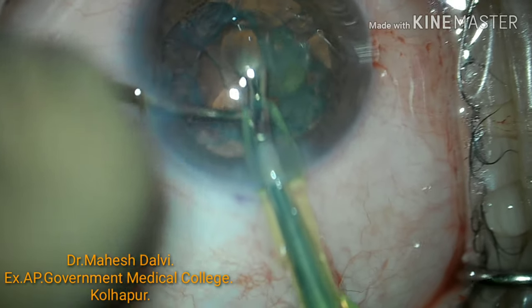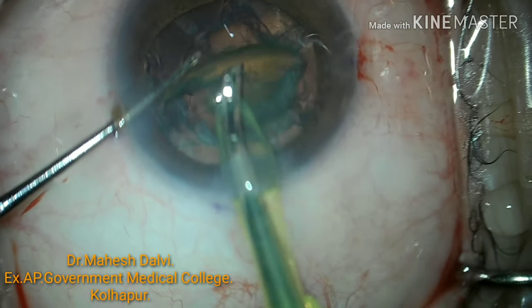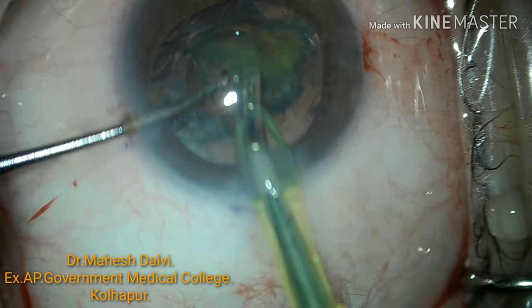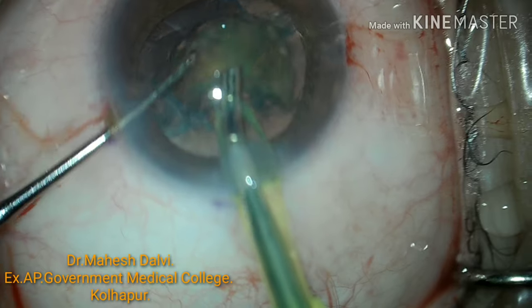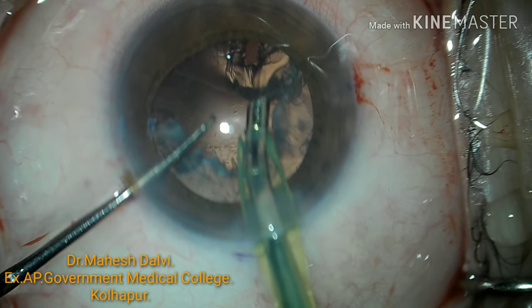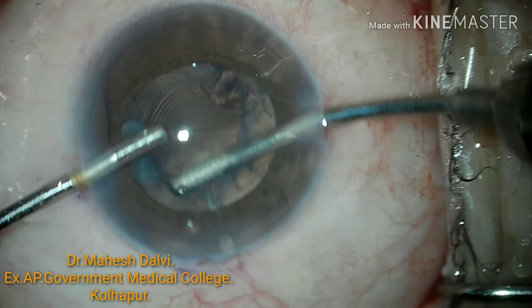Here you can see how convenient it is to use the side port for the left hand and the main incision as well as side port incision. Even though we can take the incisions without this marker, it becomes quite easier to have the same incisions at the same site, and we can easily perform bi-manual techniques with the help of this instrument at uniform sites.